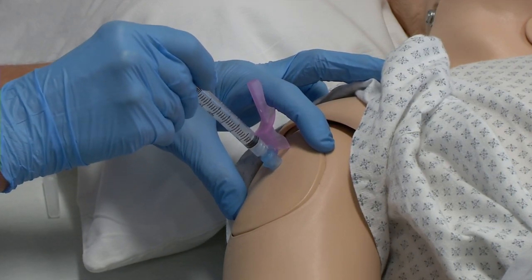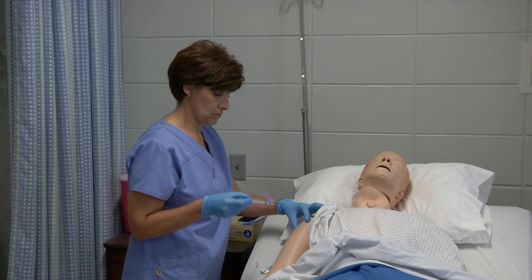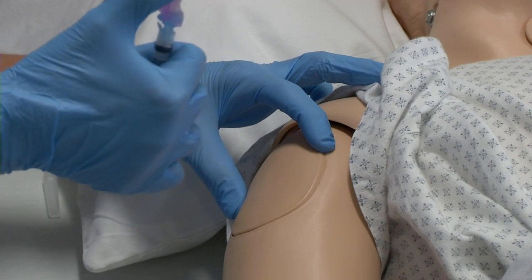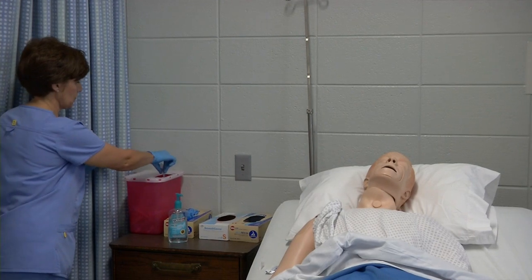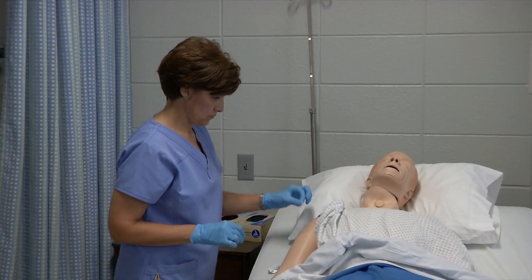After you have injected the medication, you're going to remove the needle. You're going to cap it for safety, and you're going to dispose of it properly. You're going to ensure that the patient is not bleeding, or a Band-Aid is applied if necessary.